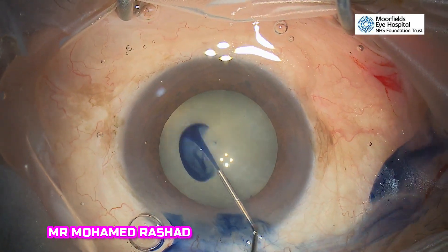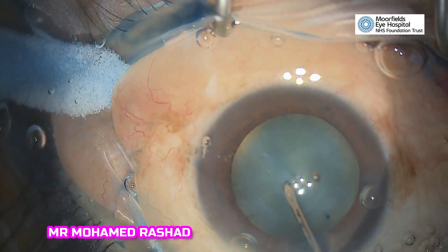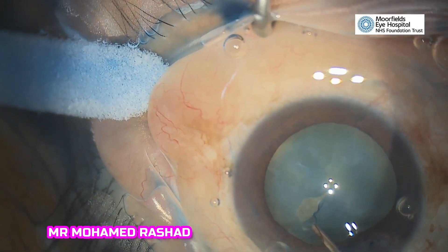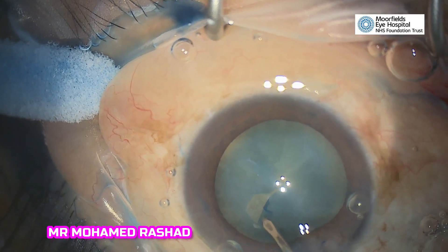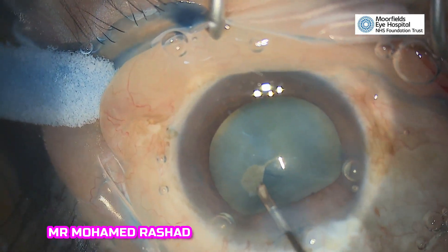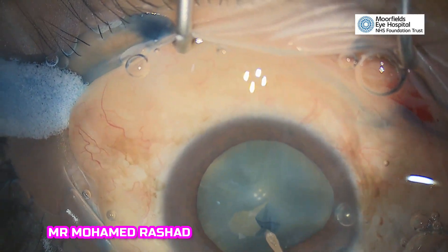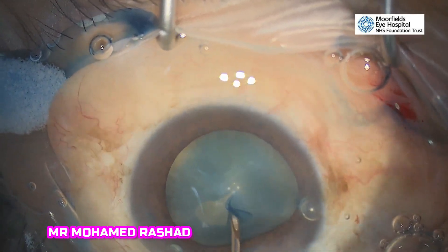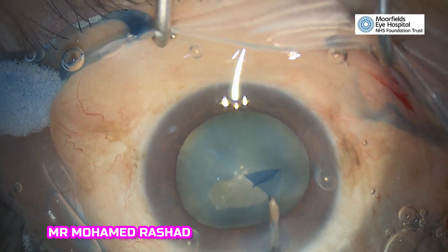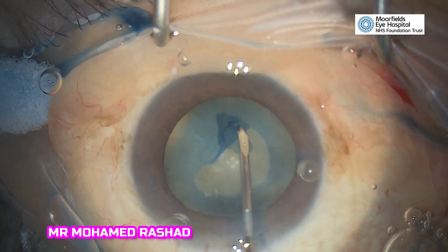We used the usual steps for dealing with the white cataract: trypan blue staining with capsulorrhexis, aiming for a small rhexis with high-viscosity OVD to avoid the Argentinian flag sign.